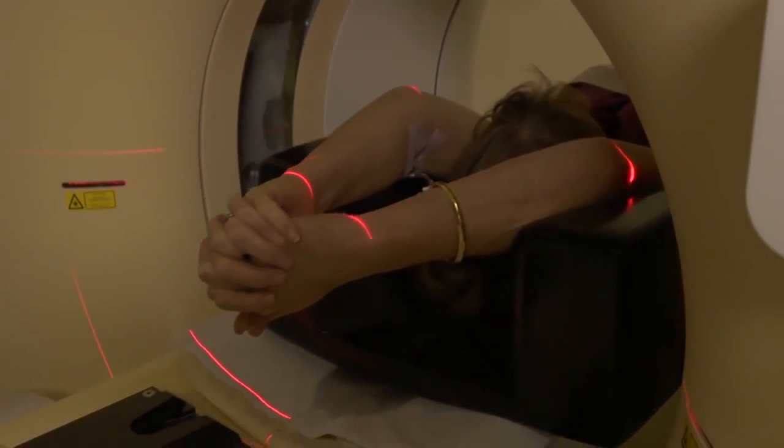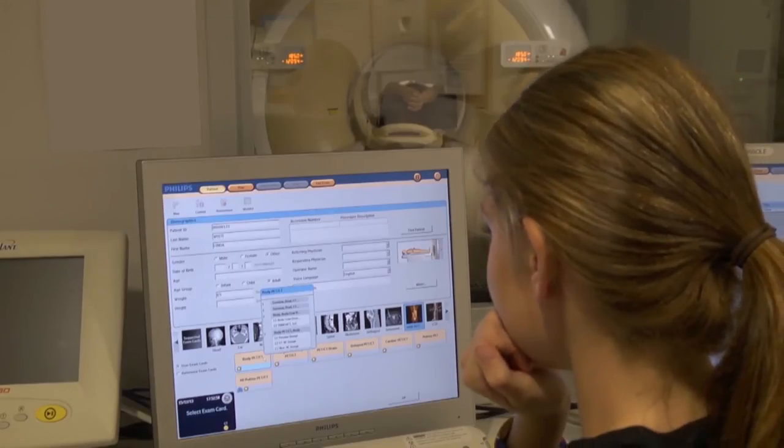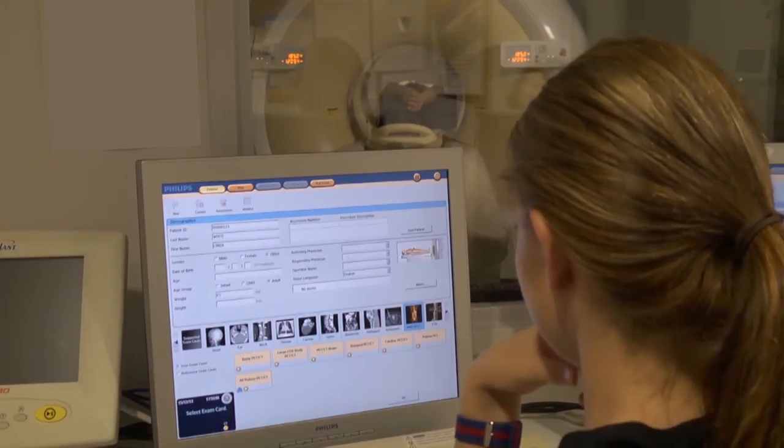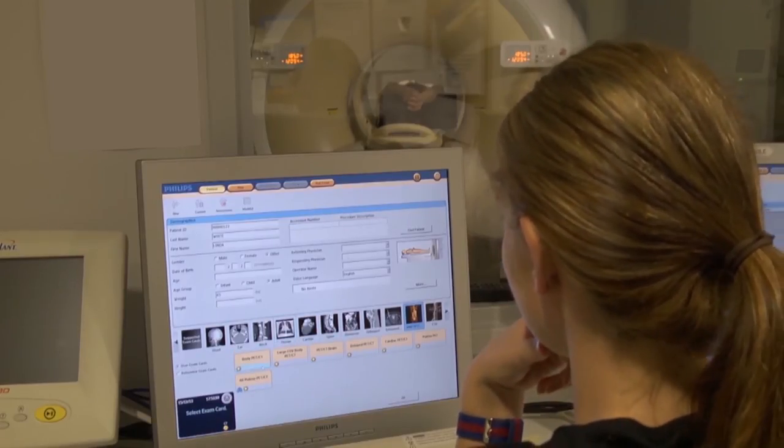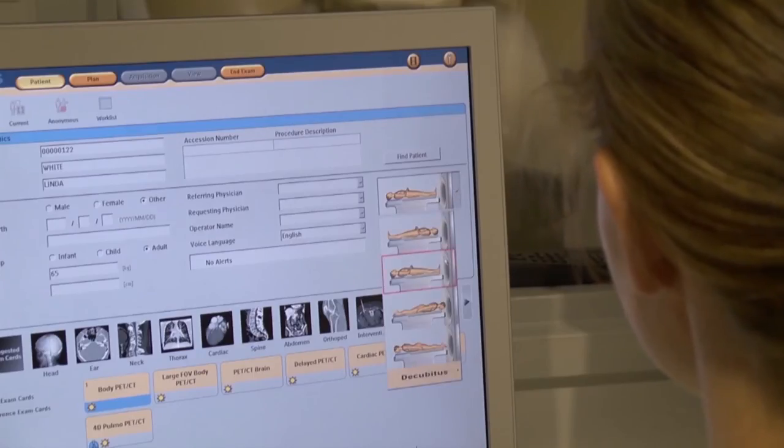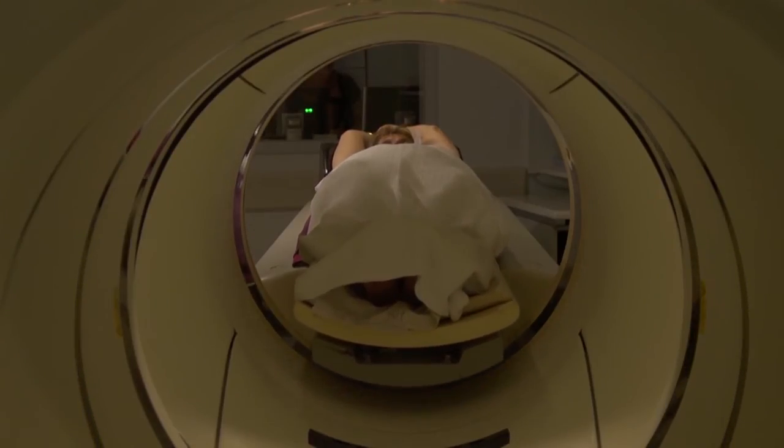The technologist sets up the scan along with the imaging protocols from a workstation in the control room. A low dose CT scan, called a scout scan, is then performed to further assist with the positioning of the patient and the setup of the scanner. This scout scan is completed relatively quickly.